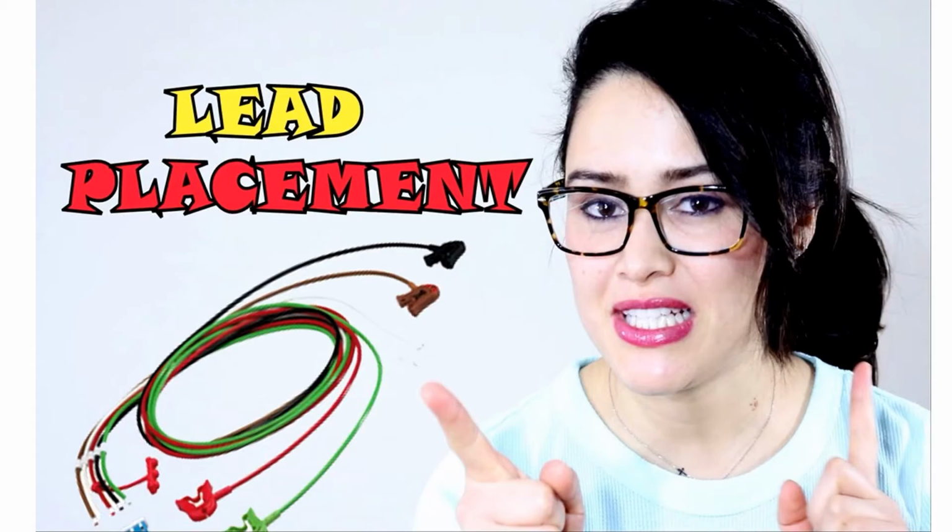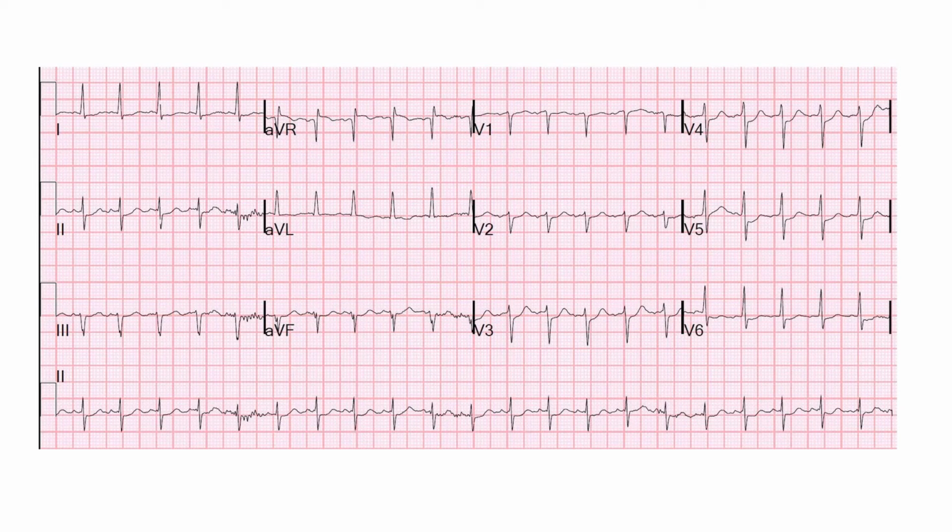All right, time to jump in to lead placement and interpreting ECGs. Here we have a standard 12-lead ECG. They're a little bit confusing to look at, so I'm going to walk through it with you. The x-axis is time. The ECG machine automatically changes leads as it's reading over time. So we have 3 total rows, and each row switches through 4 leads over time, giving us a total of 12 leads to read from.